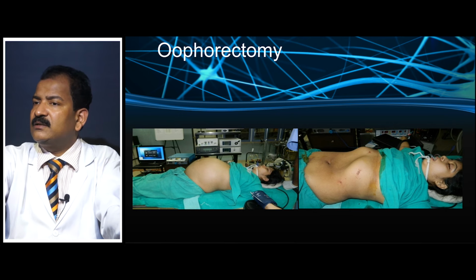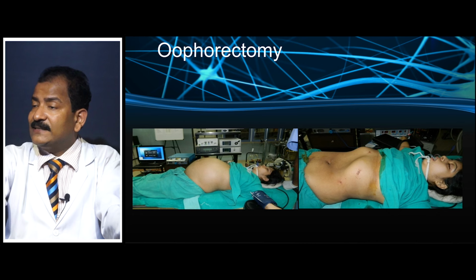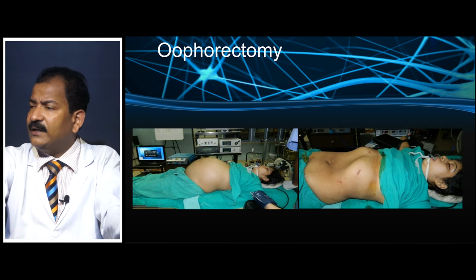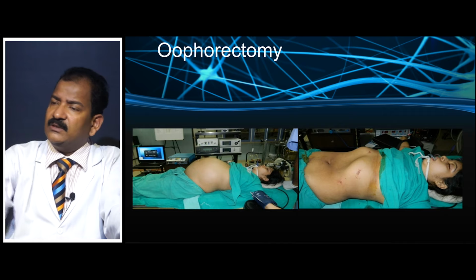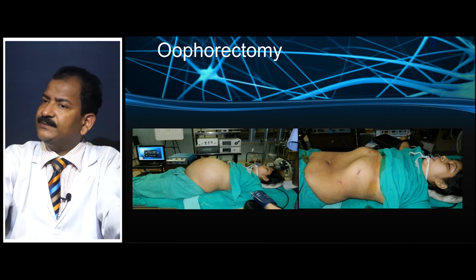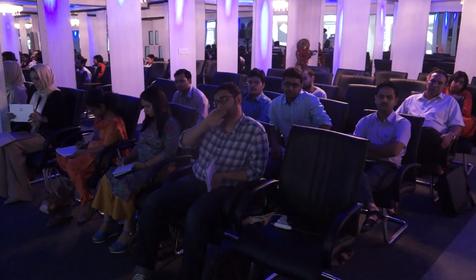Morcellation is not very effective for soft tissue. The morcellator does not work very nicely for soft tissue, but you can split it into two halves. You can put it in the endo bag, and then you can take it out after little enlargement of the incision. That is possible, but colpotomy has the advantage that it is invisible and it is easy.